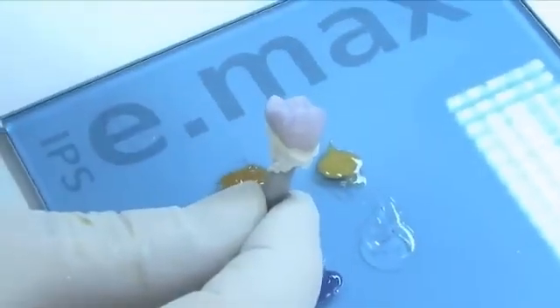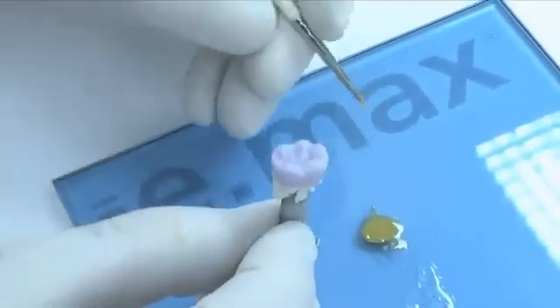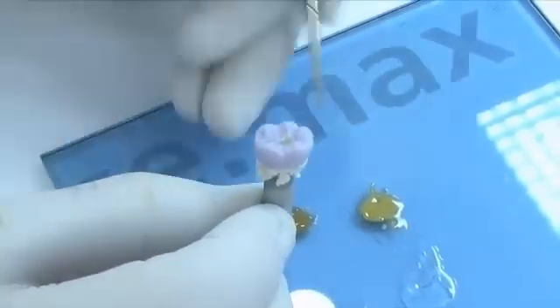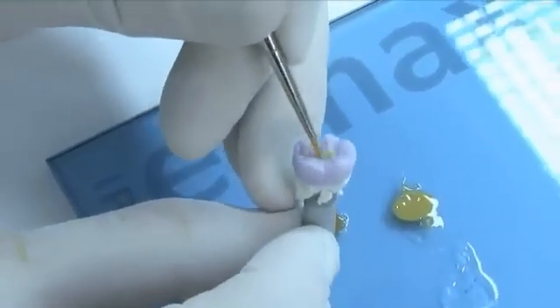To add warmth on the occlusal surface of the restoration, apply a stain color such as olive or sunset in the area of the central fossa. As with all shades and stains, ensure the stain paste is very subtle in appearance prior to firing.